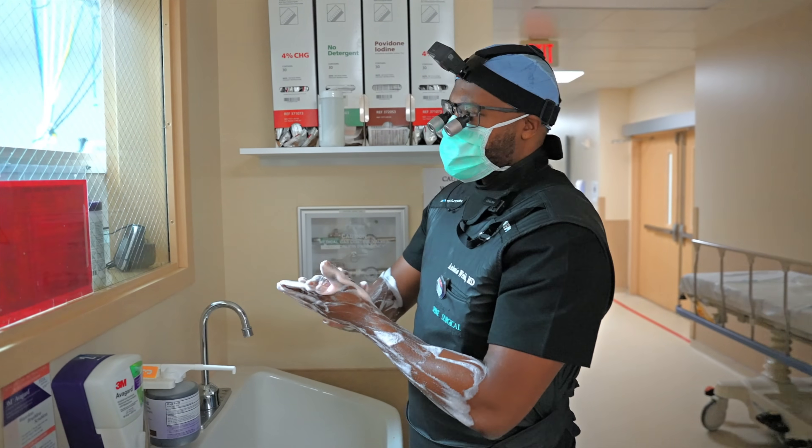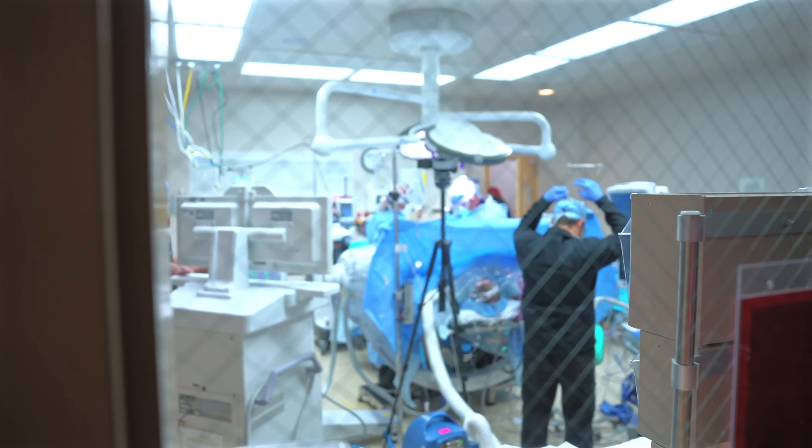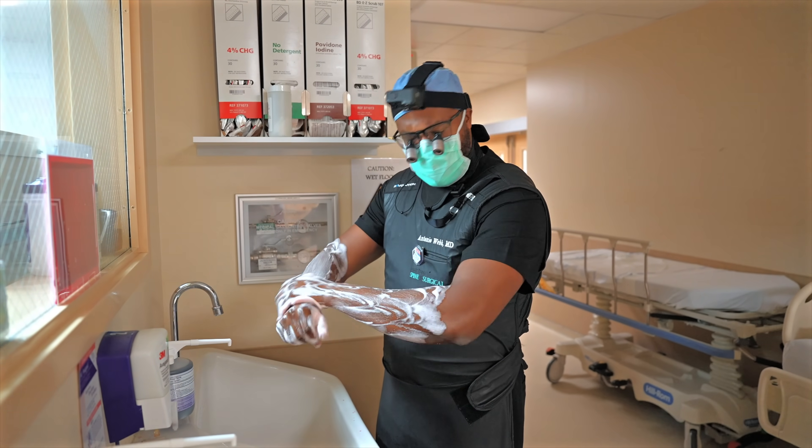My vascular surgeon is inside the case here. He's going to make an incision on the lower aspect of the abdomen and will give me vascular access — he'll open it up and I will go in and do my part. About to get started here soon.